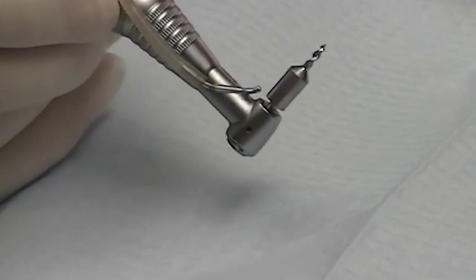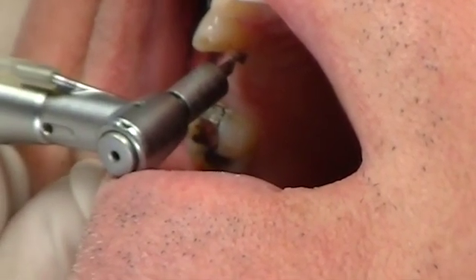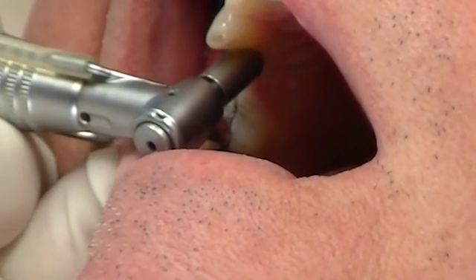Another wonderful tool that I use to make my implant surgery a little easier is something called the MD Guide — the mesial-distal guide. We purchased these from Golden Dental Solutions here in the Detroit area.